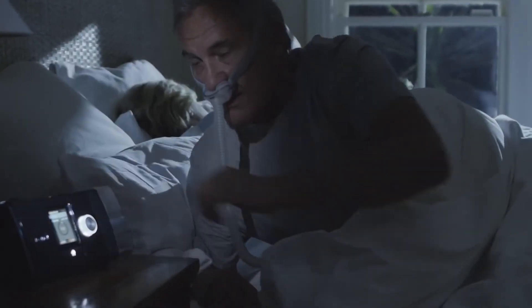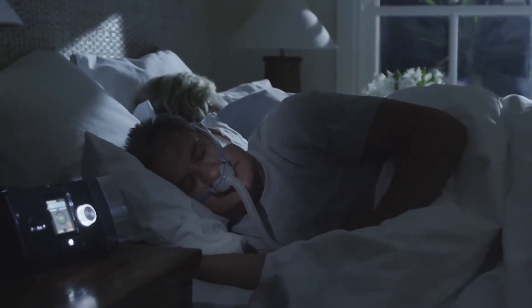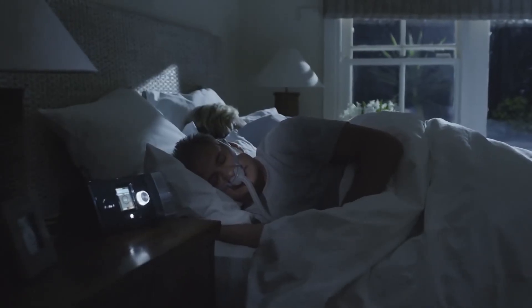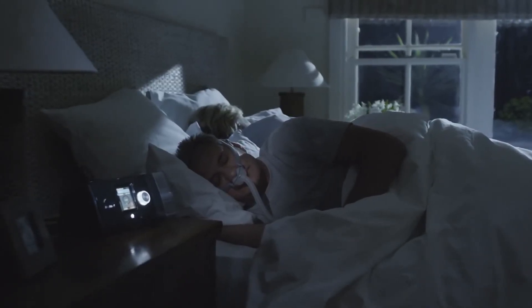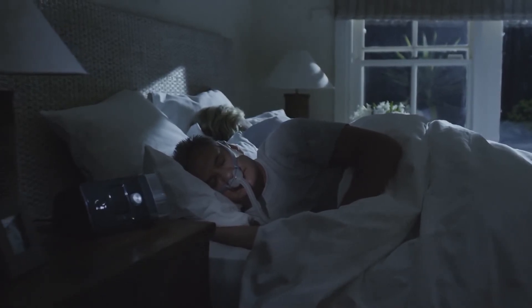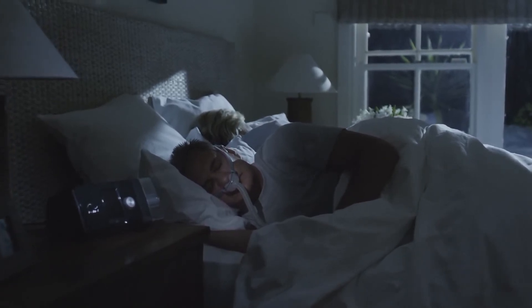Your device is designed to deliver automatic comfort throughout the night, so just plug it in and you're ready to go. Each device also has a built-in ambient light sensor that adjusts the brightness of the screen based on the light in the room, while the screen's backlight turns off automatically, allowing you and your partner to rest easy throughout the night.